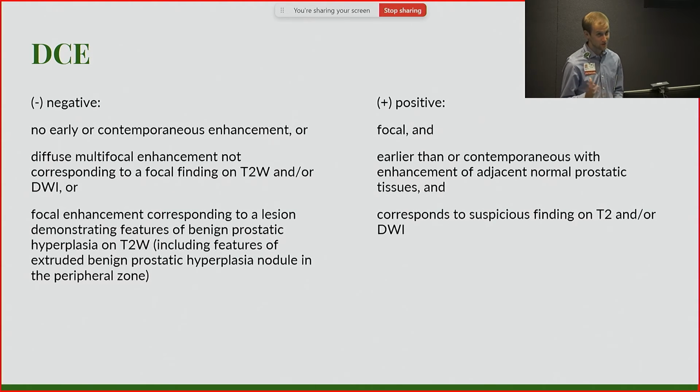A really nice thing if you look through these images is that the radiologists make it pretty easy on us, because the first series that usually pulls up automatically, if you scroll through that, is really going to show you pretty much everything that they saw. Still, I think it's good to look through the whole scan. It will usually show a measurement slide that shows the size of the prostate gland on the T2. It'll show a circled or green arrow sign of the suspicious lesion on T2. And then if you just scroll through, it'll flip right to the DWI and ADC phases that correspond.